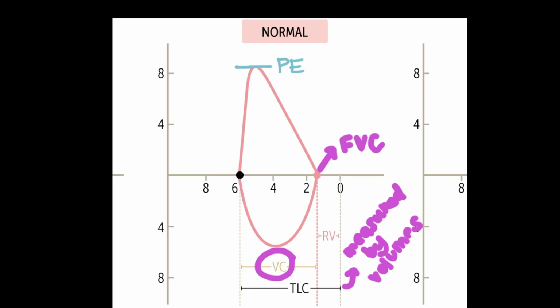At the top of the curve is the peak expiratory flow, so that's important to note. And then a number that's right in the middle is the FEF 50, and you guys talked about that today in lecture. One thing important to note is that the FEV1 is not on this graph, and that's because the FEV1 is a measure in time, and as you'll note, neither of these axes have time. So that's just something I want you guys to be aware of.